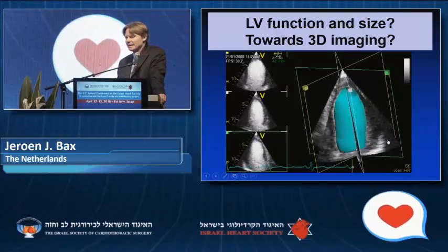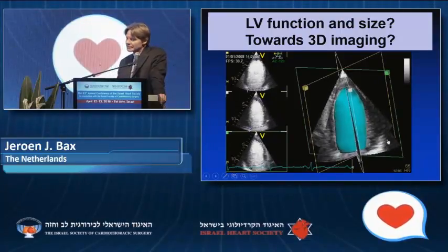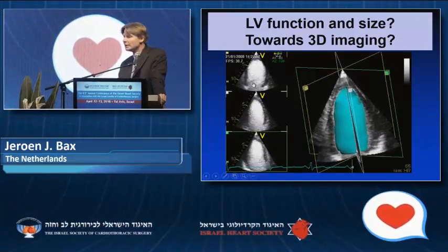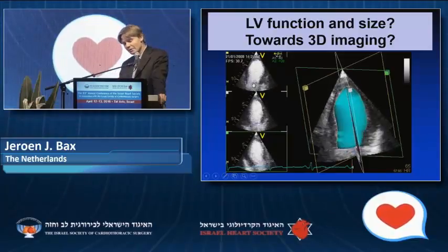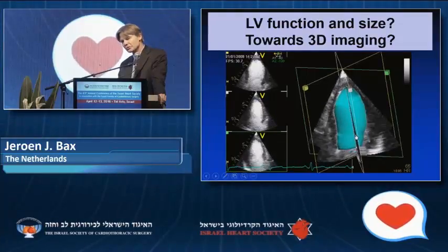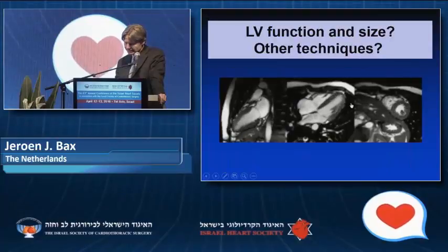a full day to post-process one of these images, I said, this is never going to make it. But now you have a probe, and the probe acquires this view, and this view, in one go. And so from these three acquisitions with one shot, you can then post-process the three-dimensional ventricular structure. And again, if you give the contrast, as you see here, it's very easy for the software to post-process that.